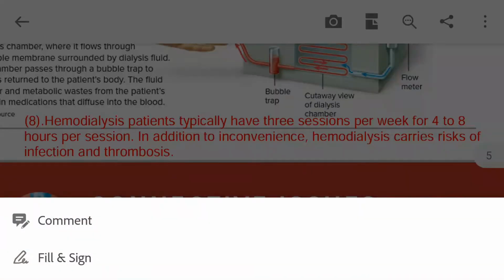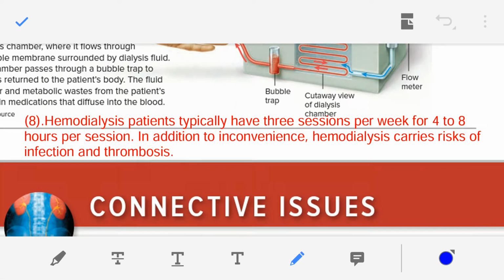Now the eighth point we are discussing. See, hemodialysis patients typically have 3 sessions per week. So in a week, hemodialysis is performed on the patient 3 times, and the duration of one session is 4 to 8 hours. So the complete process of hemodialysis takes 4 to 8 hours per session.